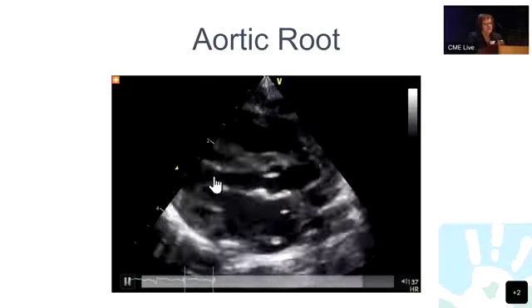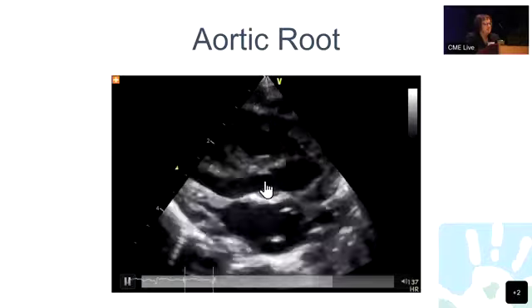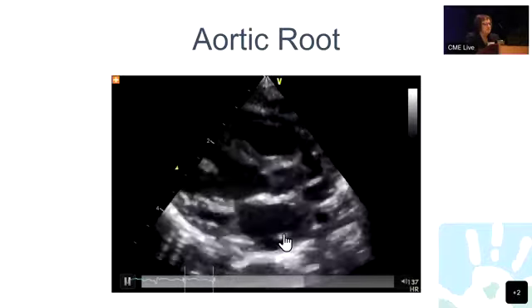So here we see a heart with at least mild LVOT and aortic hypoplasia. We would measure the aortic valve right here, our root right here.